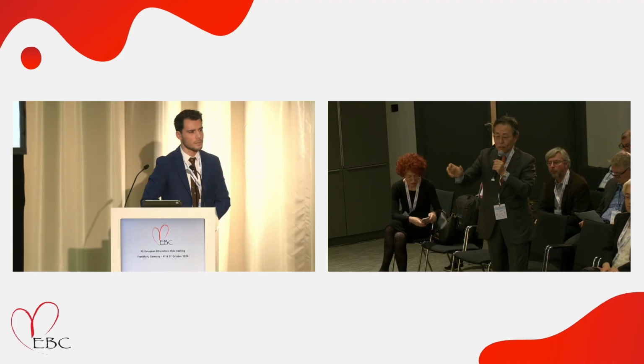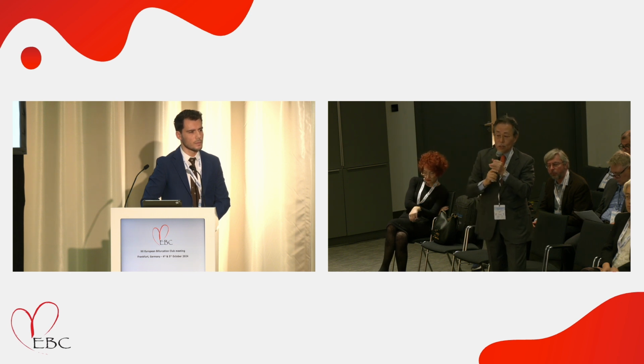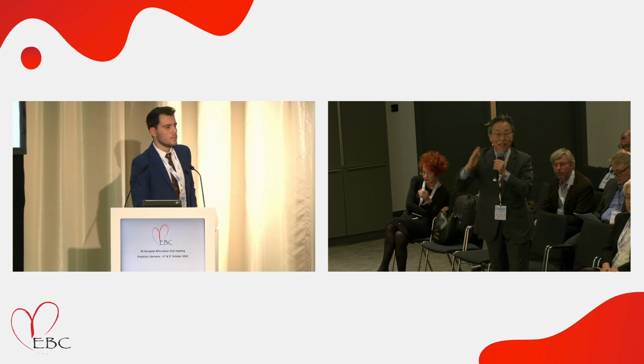So if you use the POT-side-POT technique, I recommend a short balloon or proximal balloon edge only dilation in the side branch ostium, rather than long balloon dilation from the left main to the LCX. Long protrusion in the left main is not recommended.